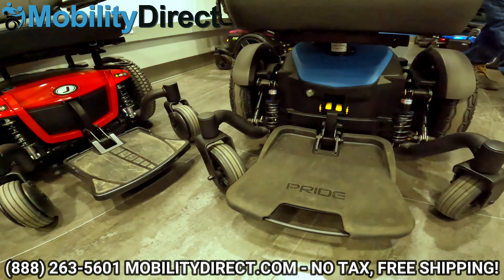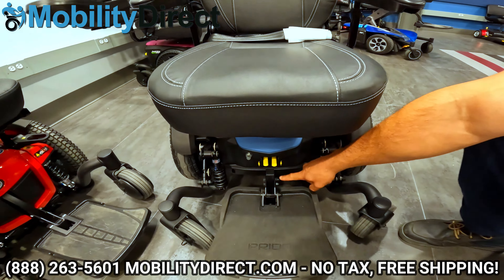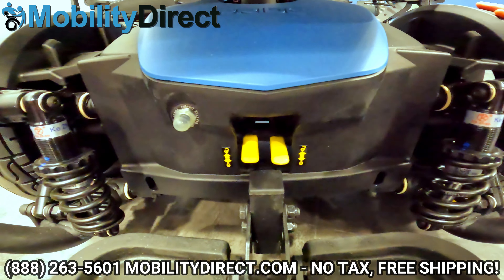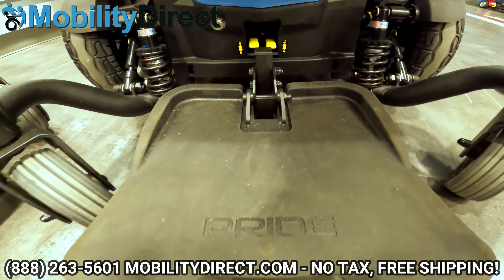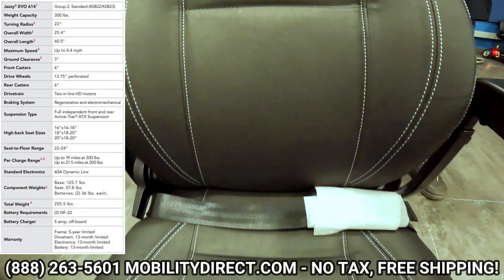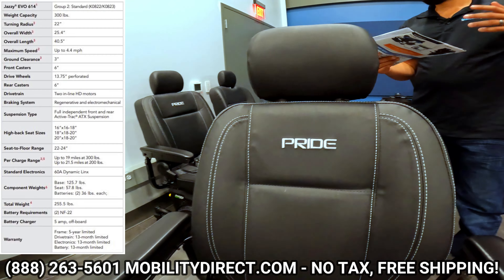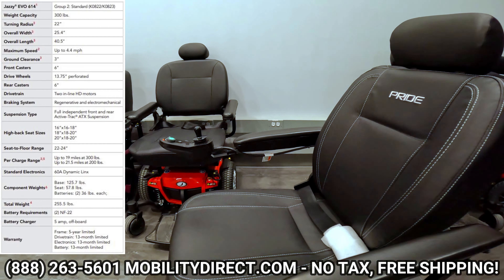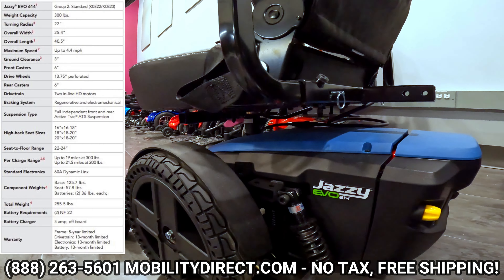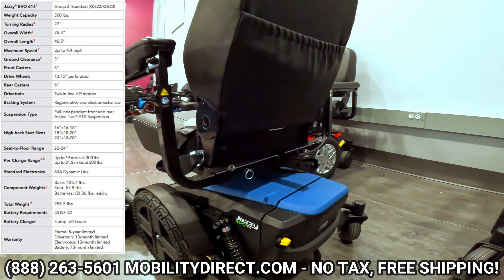They're really nice colored panels that you can switch out if you wanted to. Here we're showing you the flip-up foot plate and the front casters. The foot plate is height adjustable and you've got some really nice suspension which is also adjustable. It is a mid-wheel drive power wheelchair so it's going to have an extremely tight turning radius. The 614 has a 300 pound weight capacity, a 22 inch turning radius which is phenomenal, a top speed of 4.42 miles per hour, three inch ground clearance, 14 inch solid drive tires — no flat tires to worry about — six inch casters on the front and rear, an overall width of just over 25 and a half inches, and a length of about 40 inches, with fully adjustable front and rear suspension.